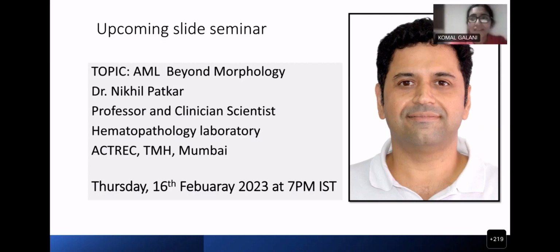We had only 2 questions. I think sir is online, sir. If you can. Yeah, Nikhil, I'm very happy, particularly about the selection of cases. Cases 1 to 3 you dealt with APL, and case 4 was cupping, which most of the residents, at least in pathology, initially call a nucleolus. That may be your experience also. Then case 5 had another flavor, that was AML with MDS, and case 6 was a classic monoblastic. I just want to say a few words about the APL cases.